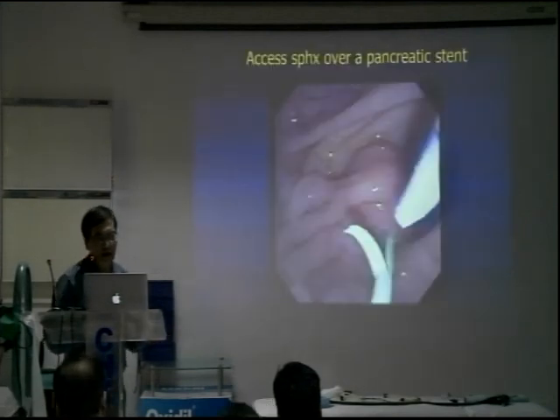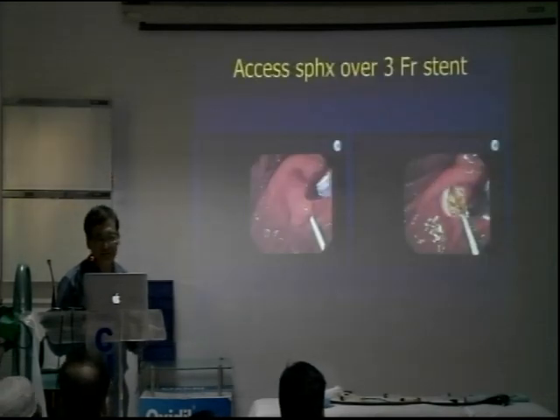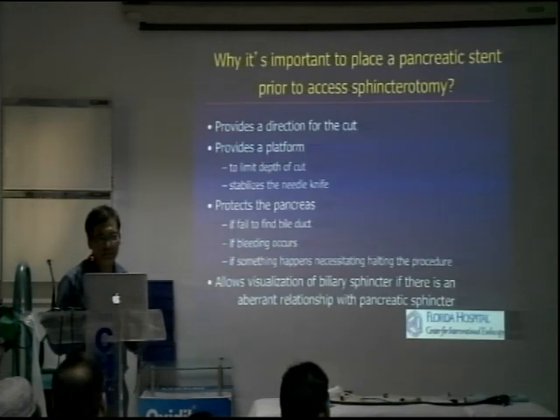Okay. I don't think we need to go over the needle knife, right? No? Okay. Okay. Yes.